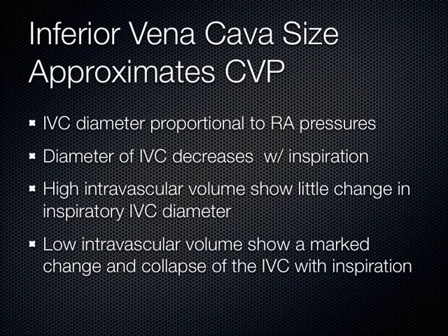The IVC dumps into the right atrium. So you can approximate the pressure in the right atrium by looking at the IVC and how the IVC responds during inspiration. So as you breathe in, the IVC collapses, okay? Depending on your level of hydration. If you're really dehydrated, and you look at your IVC and you breathe in, you'll see that IVC collapse down, the walls will touch.